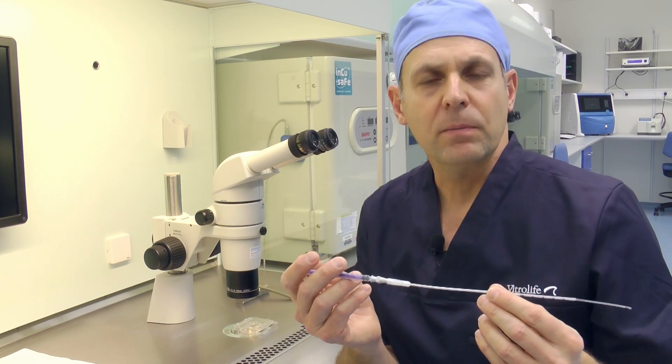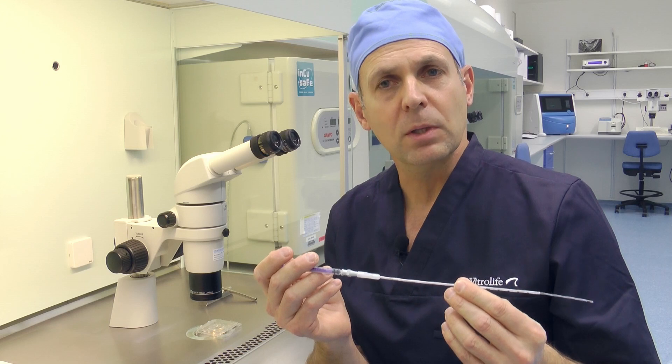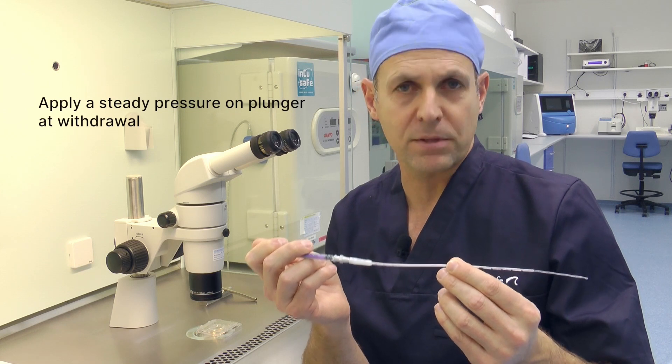During the Embryo Transfer, expel the embryo in approximately 30 µL of Embryo Glue and slowly withdraw the catheter from the uterus while maintaining a steady pressure on the plunger of the syringe.